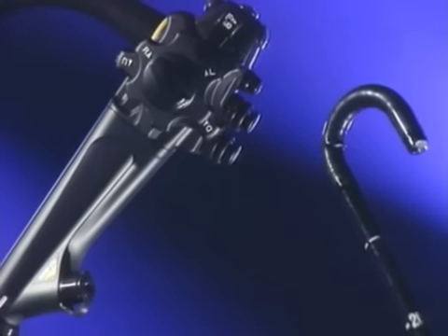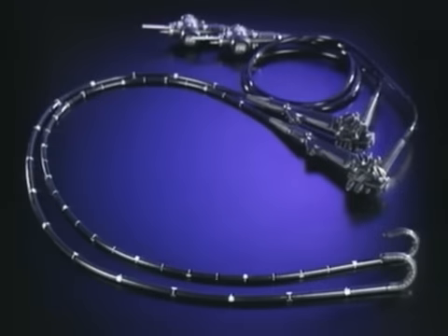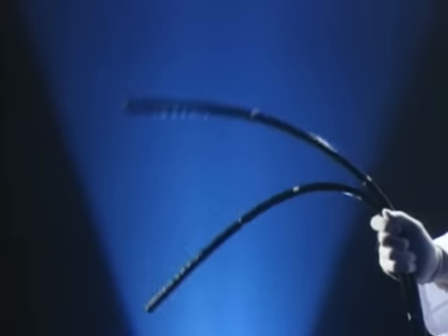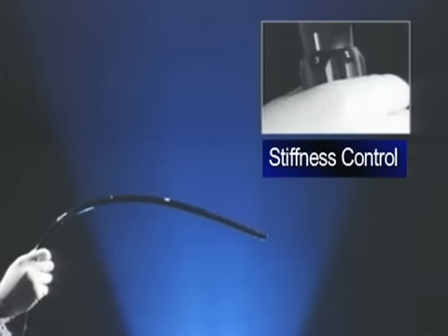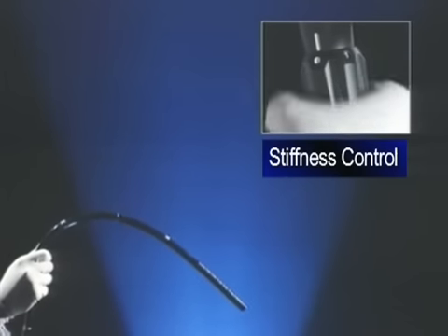The InnerFlex variable colonoscope gives the endoscopist control over scope stiffness. It has a variable stiffness insertion tube. Twisting the stiffness control varies the insertion tube flexibility from stiff to floppy.